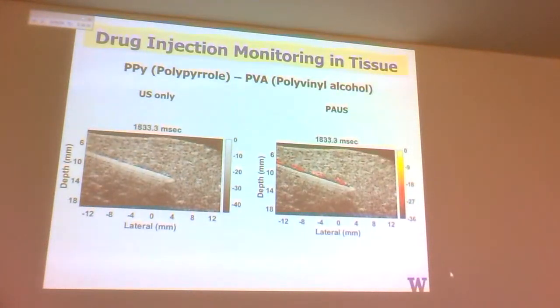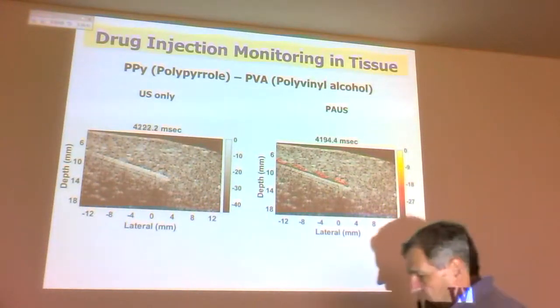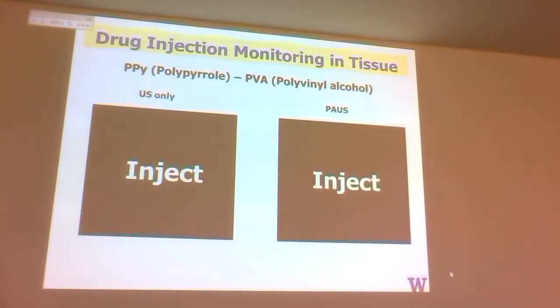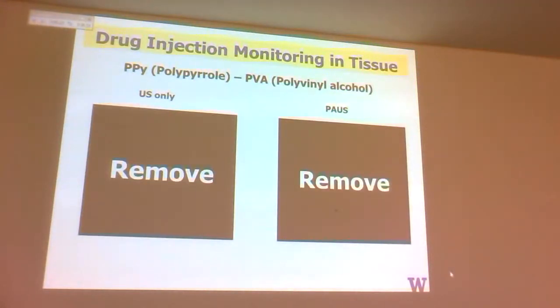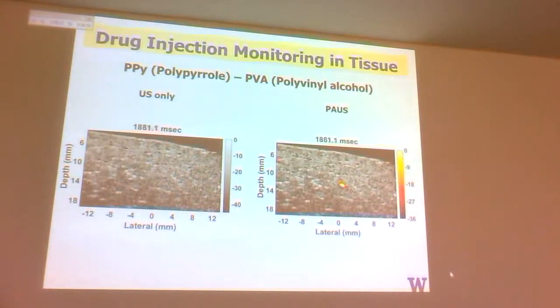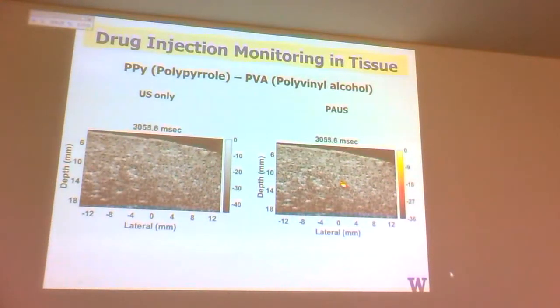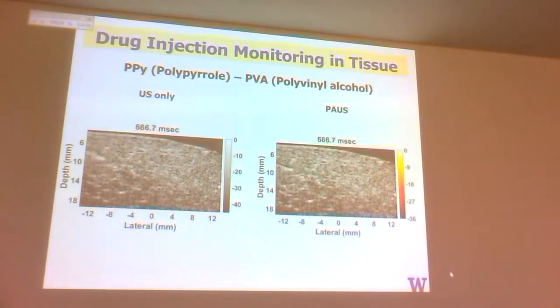Okay? So, imagine this is a procedure in which you are delivering labeled stem cells to a particular area. And inside those stem cells you had an agent, which we'll learn how to design in the next module. An agent which is monitoring some process in the stem cells and will allow you, with a particular wavelength, to sense that photoacoustically. All right?